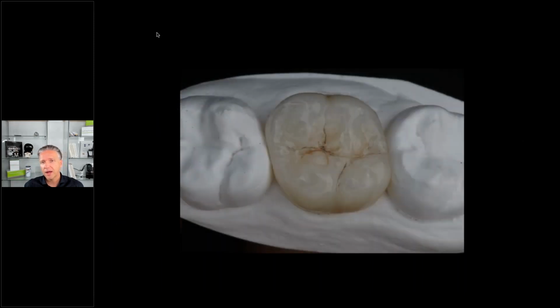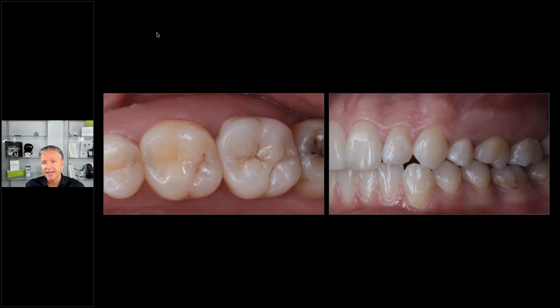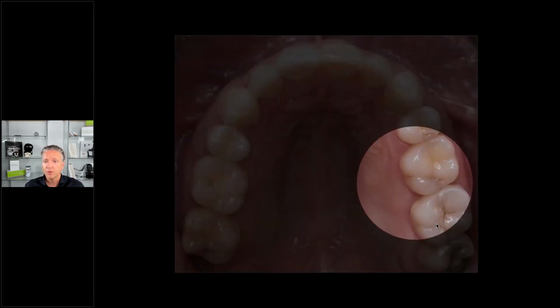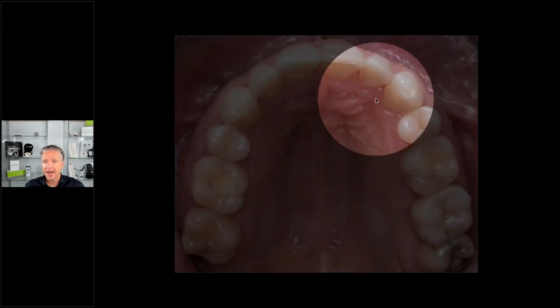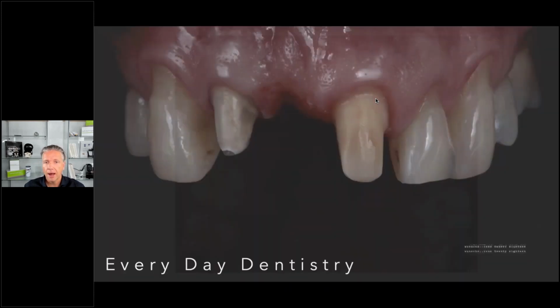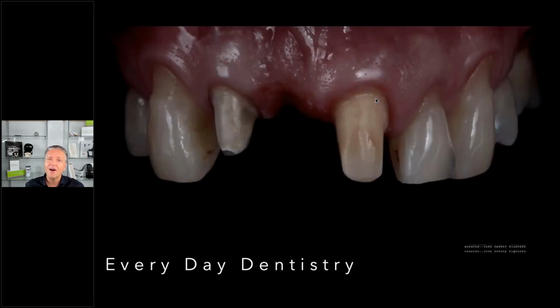So to fabricate monolithic aesthetic crowns like this in a posterior area, they're really fitting nicely in and blending into the whole scenario. By the way, the crown is here, so it's really blending in nicely and has a very natural look. Again, I'm trying to fabricate teeth, not crowns. That is very important, so we have to evaluate the case.